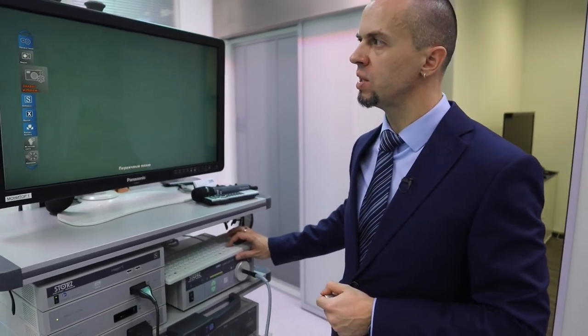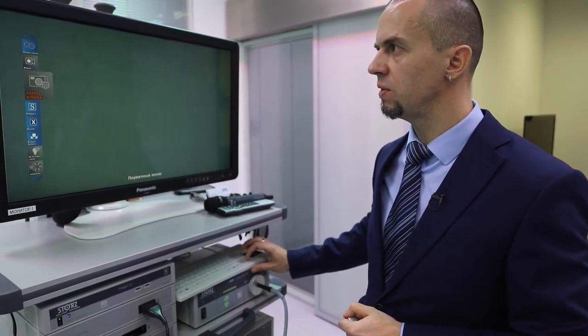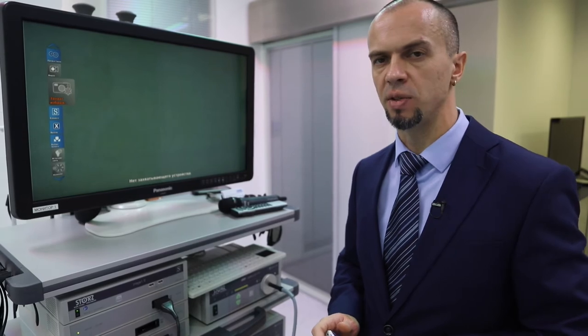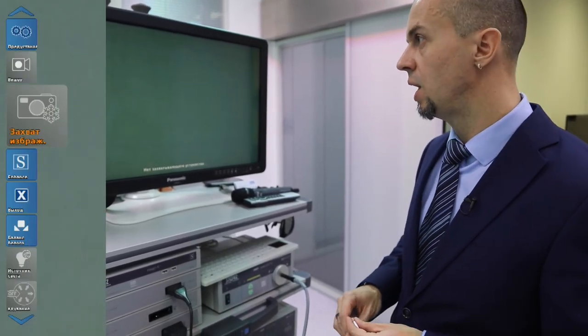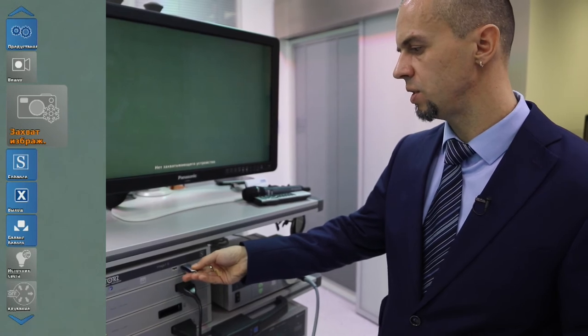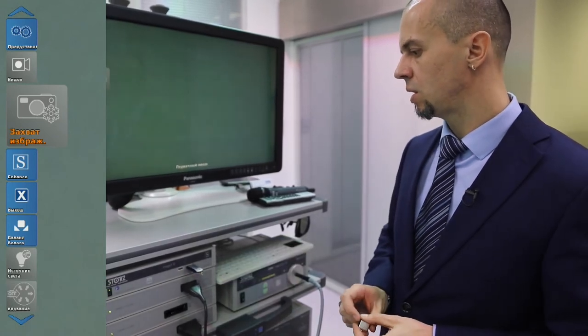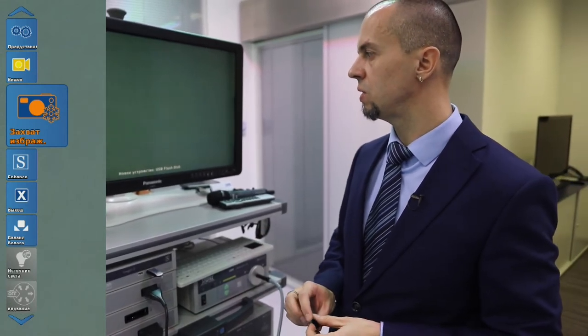Обратите внимание: меню захвата изображения и записи видео недоступно. С чем это связано? С тем, что мы просто не вставили USB-флешку для записи, либо эта флешка не подходит — не отформатирована в FAT32. Итак, у меня есть штортцевская флешка. Вставляю её в систему. Какое-то время система её распознаёт — и теперь я могу записывать видео и захватывать изображение.